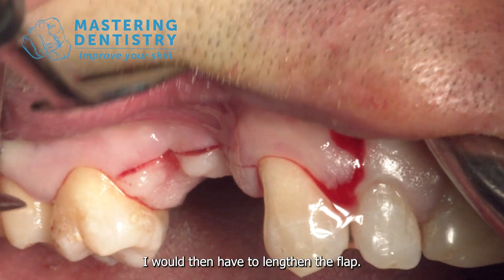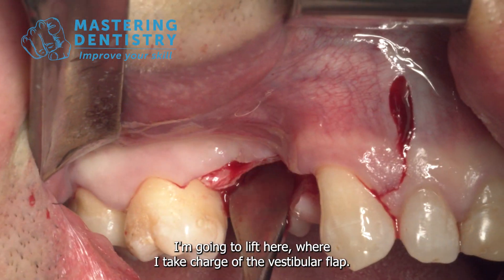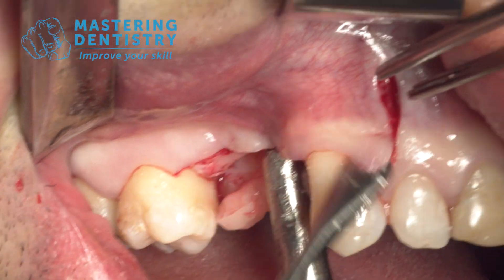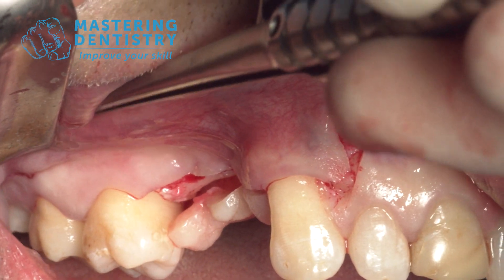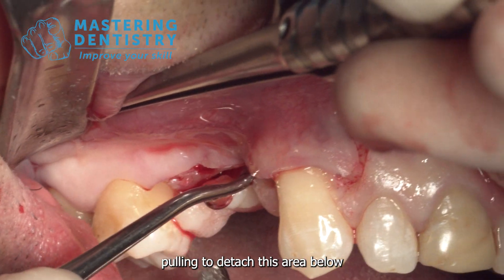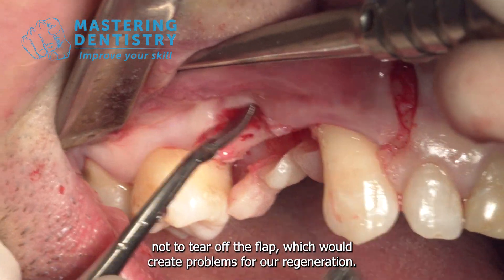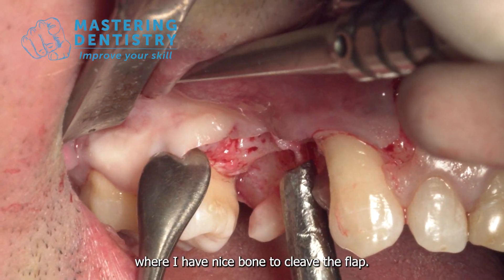I will then have to lengthen the flap. I go to detach the palatine flap and lift here where I take charge of the vestibular flap, starting from the drain with the small part of the periosteal elevator. The fibrous tissue makes it difficult to detach — we have to be careful not to tear the flap, which would create problems for our regeneration. I return to the area where I have nice bone to cleave the flap.